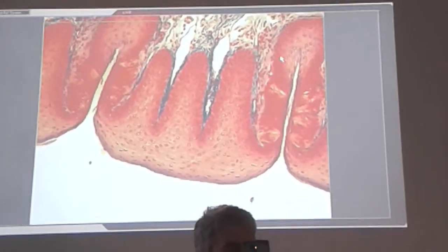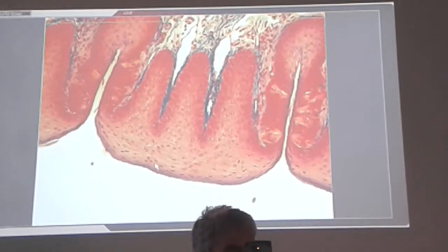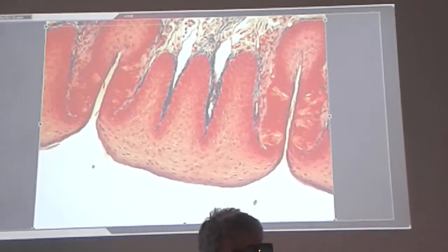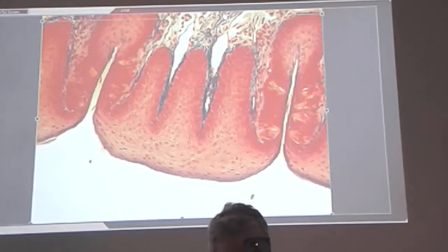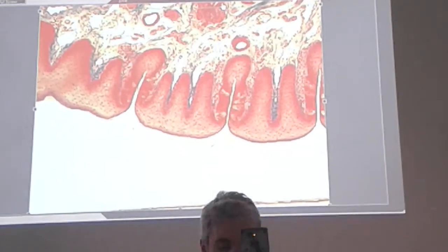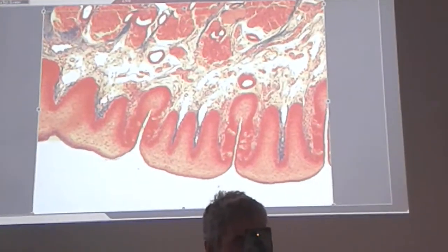The rectangular shape gives us a tip, and then two sulci, and then the base, the lamina propria. Now, going back to the lower magnification, we can still observe other cellular elements.